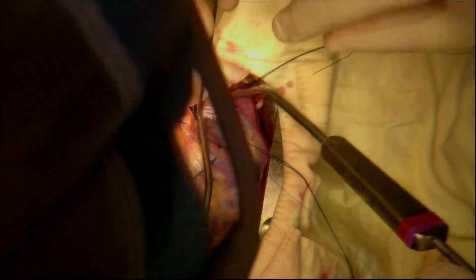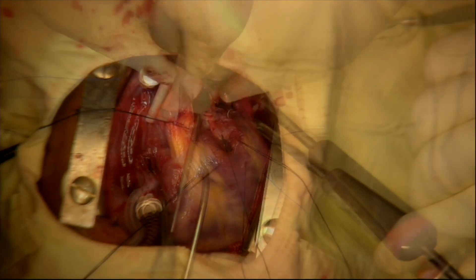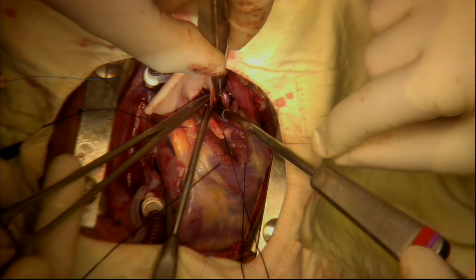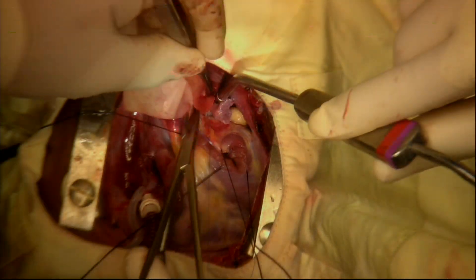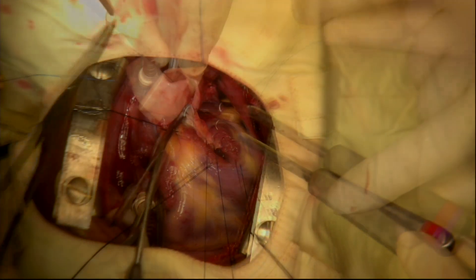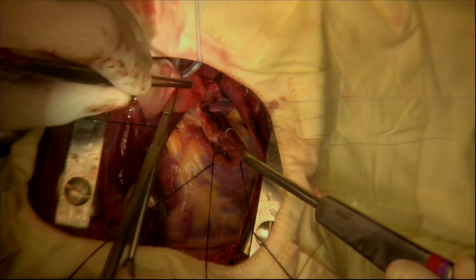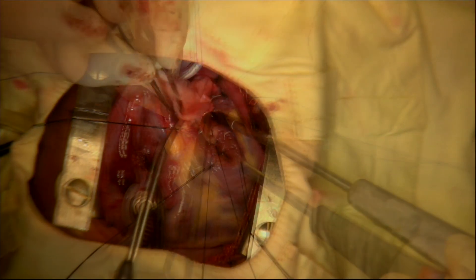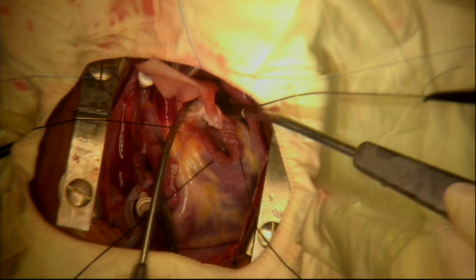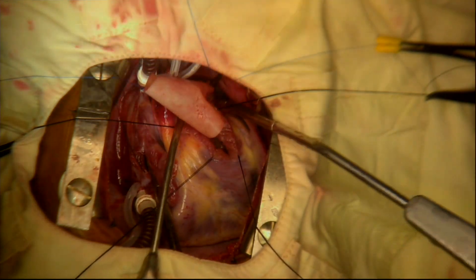At the level of the annulus of the pulmonary valve, the suture is brought out and secured. The opposite needle is then taken up and used to advance the suture line in a continuous fashion up the left side of the pulmonary arteriotomy. At the level of the annulus of the pulmonary valve, this suture is brought out and secured.